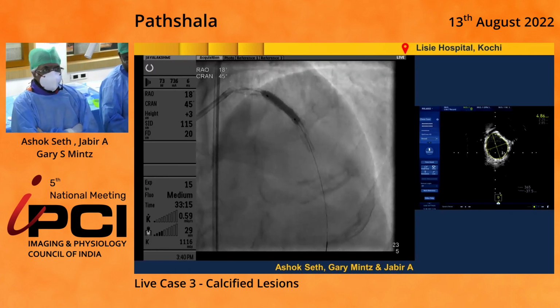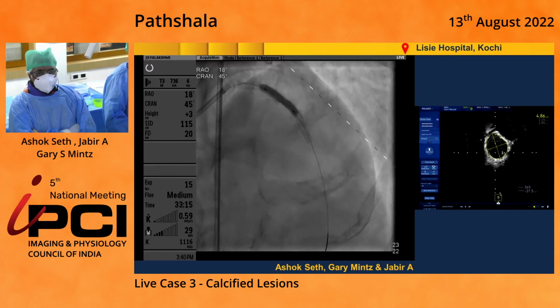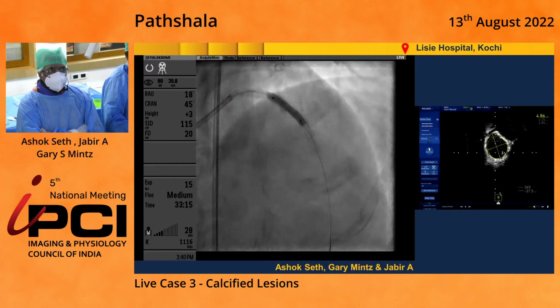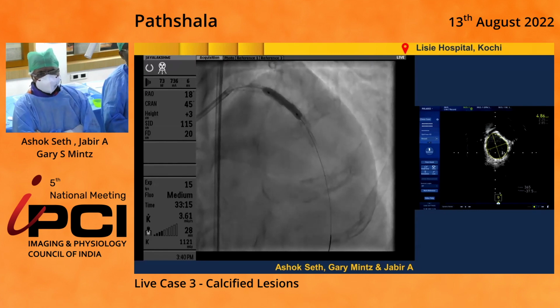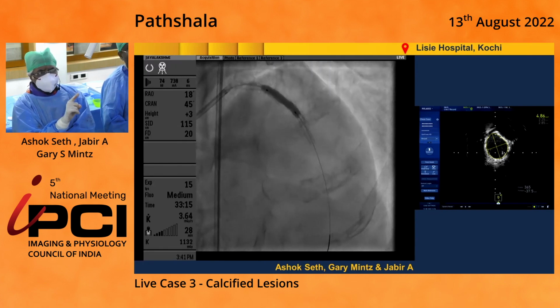All right, Ashok, we're at the end of our time, unfortunately. So maybe we'll just have one more inflation at the proximal lesion just to make sure that gives as well. That's right. And this is at 40, and this is not bad. I mean, Darshan, you can see this is at 40 and this is not bad.